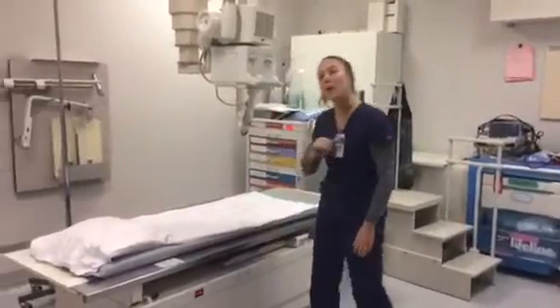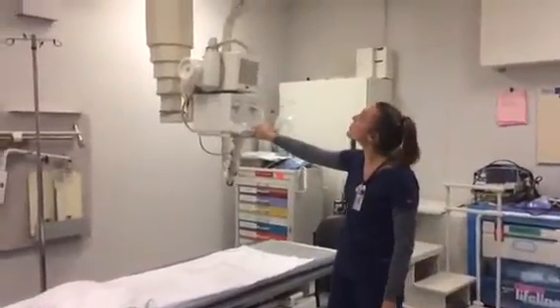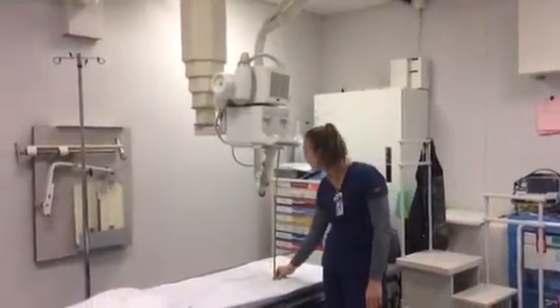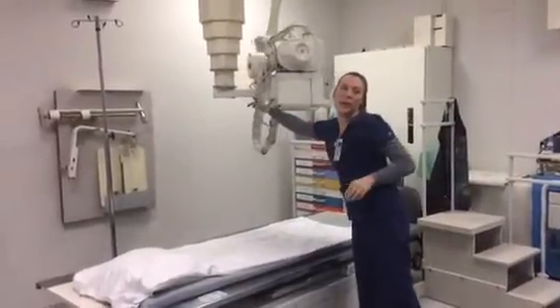And I'll start setting my room up before my patient gets here. I will detent my tube to the table at a 40-inch SID. I'm going to wag the tube out of the way to get the patient.